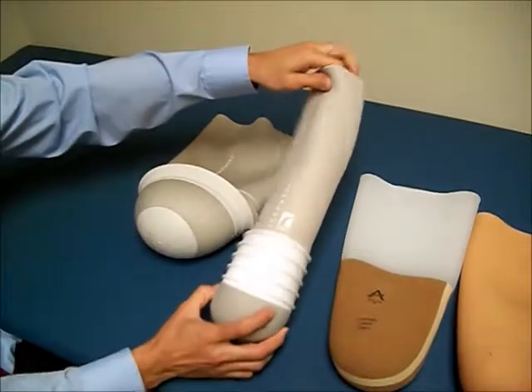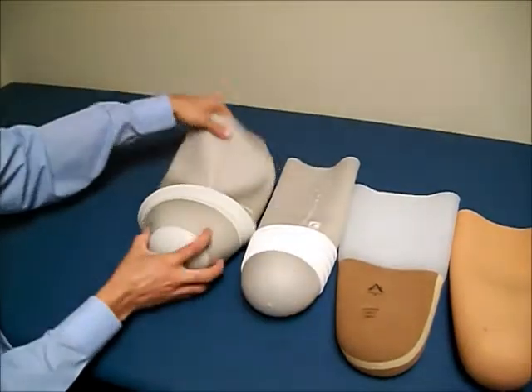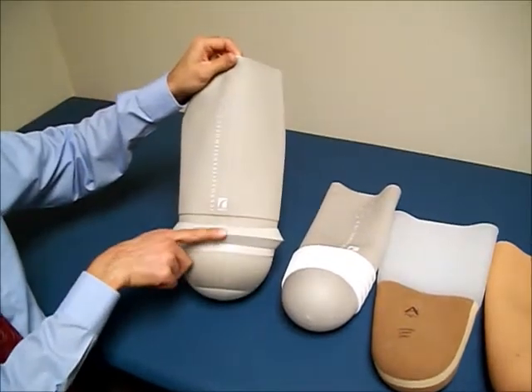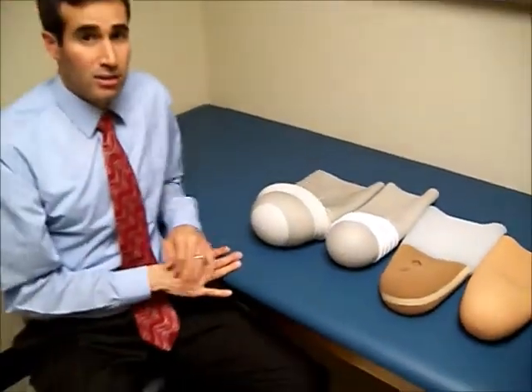For those it does work with, it can work very well. This one is more commonly used with below-the-knee amputees. This style here is designed specifically for above-the-knee amputees, and you will get an airtight socket from this seal down. Those are some neat designs that are available.